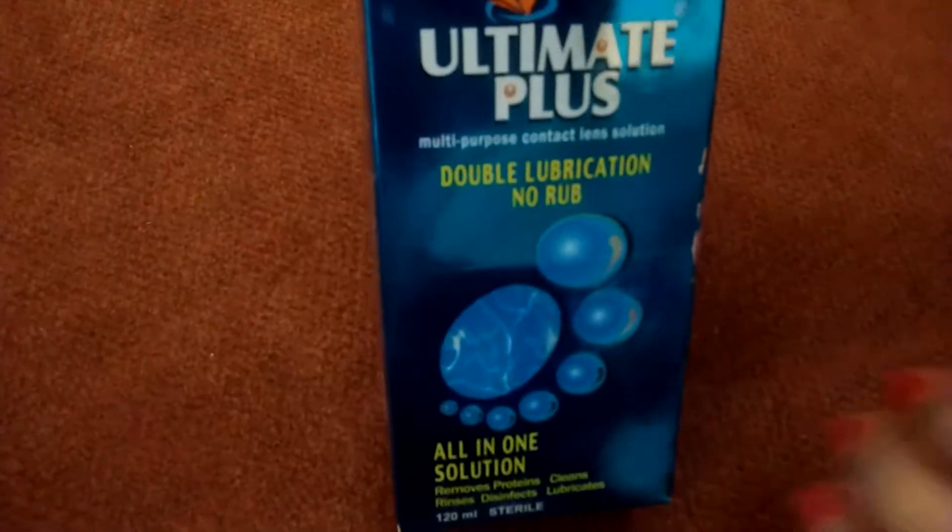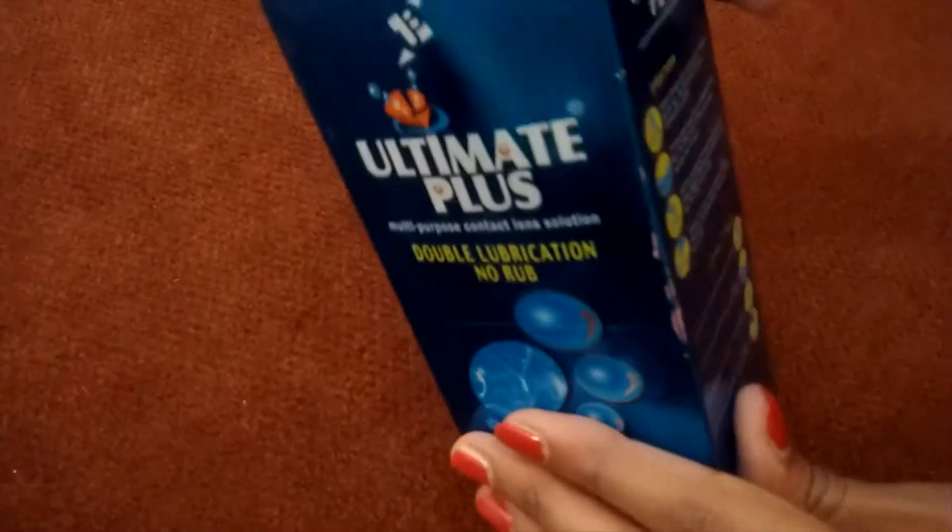Let me quickly check the description on this. They have directions on the packaging. It says: rinse well with enough Ultimate Plus all-in-one solution, and the debris on your contact lenses are removed. Then fill the lens case with Ultimate Plus all-in-one solution.